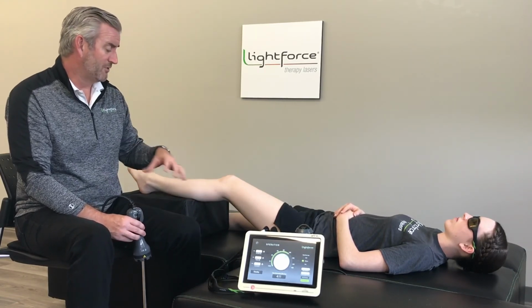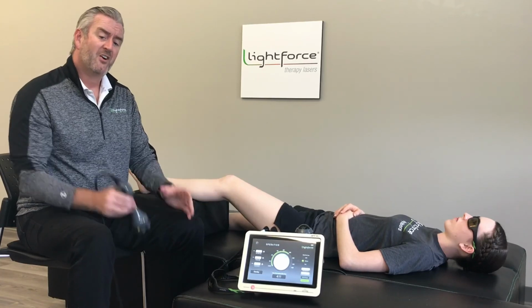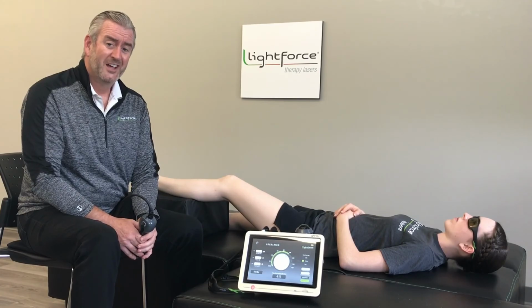So hopefully that helps. Again, by way of review, try to treat circumferentially if you have a swollen joint. Try to get some active motion with the treatment as you can. Off contact heads tend to work really nicely on the front of the knee. If you're going to use the massage ball, that usually works best in the soft tissues behind the knee. But hopefully applying a few of these things, you're going to get better outcomes with your knees, and good luck.